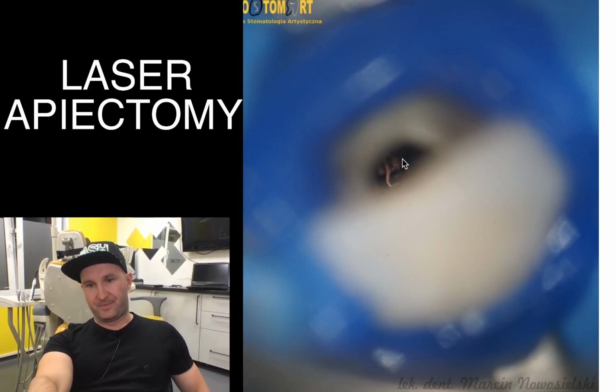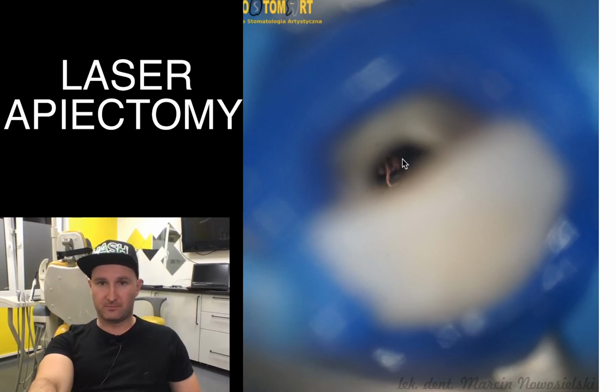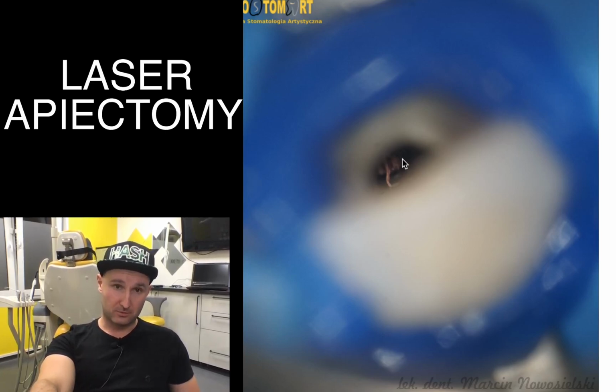This is called PIPS or SWEEPS, and this amount of irrigant solution was enough to perfectly clean the inside of the teeth from the debris, to kill the bacteria in superficial layers of dentinal tubules. But it was not possible to disinfect the deep layers of dentinal tubules.